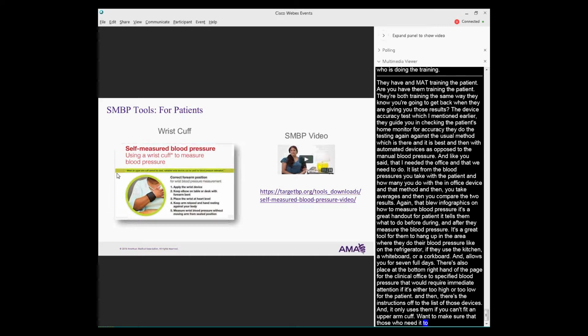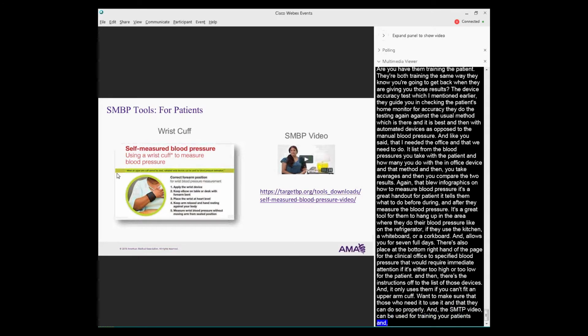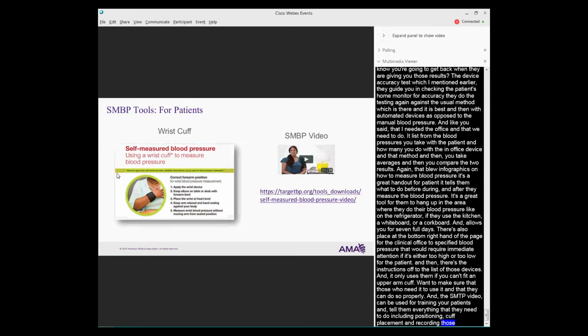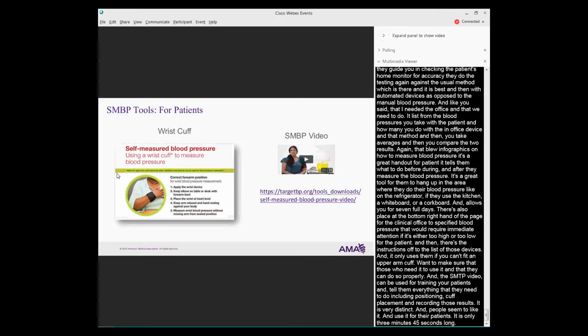And then the SMBP video can be used for training your patients. It tells them everything they need to do, including positioning, cuff placement, and recording their results. It's very succinct, and people seem to like it and use it for their patients. It's only 3 minutes and 45 seconds long, and it's available in English and in Spanish.